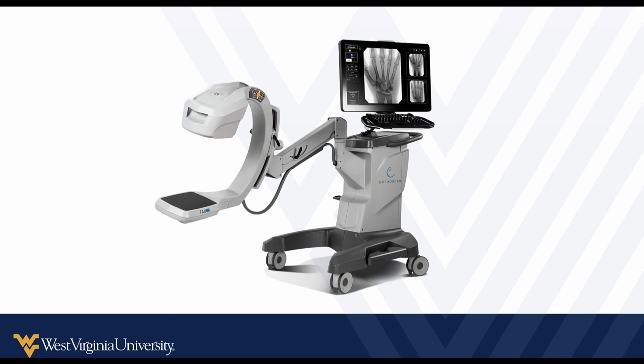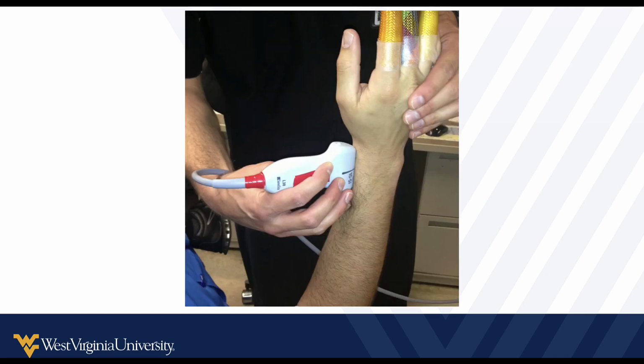If you don't always have it, it's not going to be there. But next, let's talk about using point-of-care ultrasound. If you have your ultrasound in the department, you can just look at the fracture. You're going to look at lateral edges and dorsal and maybe volar edges of the fracture fragment to look for alignment. So this is just a quick demonstration of what that might look like here.